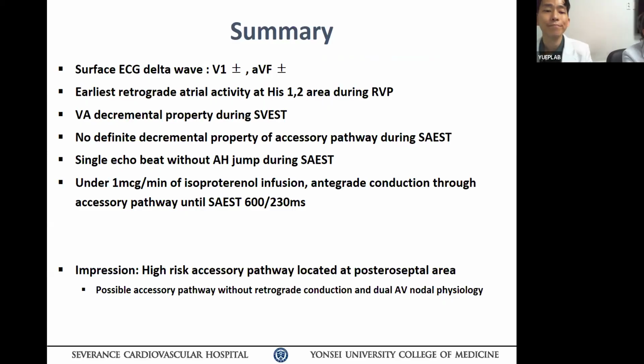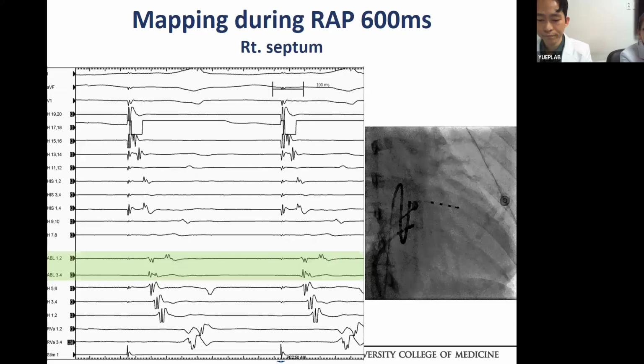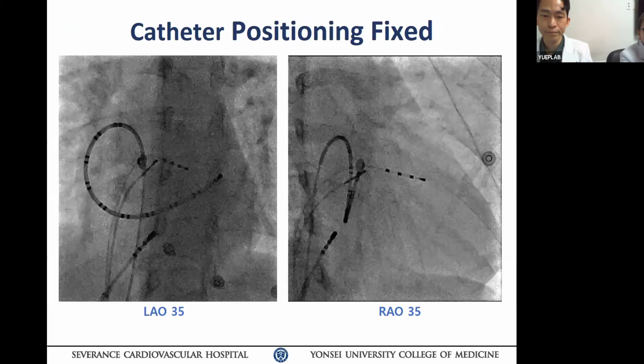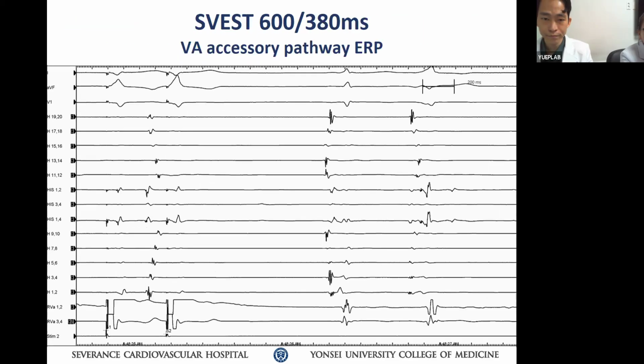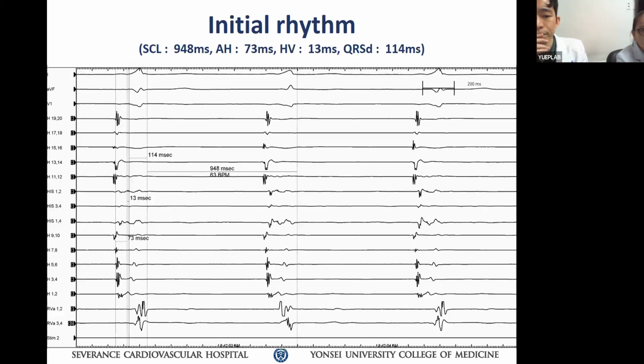But I'm just pointing out to you guys, go to the very first slide. You made the wrong catheter placement, but you did the right thing, fortunately. I want to ask one quick question. First, the tracing, the first one, intracardiac. Yeah, there you go. Look at your undesired catheter placement, let's put it that way.